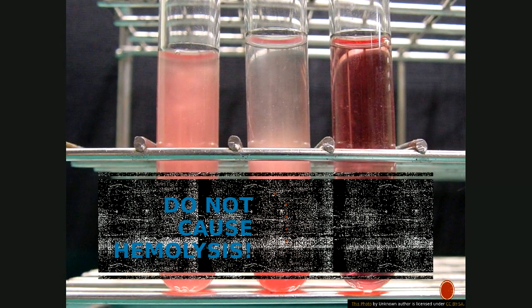Increased red blood cell fragility and high packed cell volume occur in newborns and infants. So we also want to be mindful when we're doing a finger stick not to scrape the blood off the finger, because this can also cause this. It's basically a red tinge of the plasma or serum. Serum or plasma should be yellow, and in this it's shown as red.